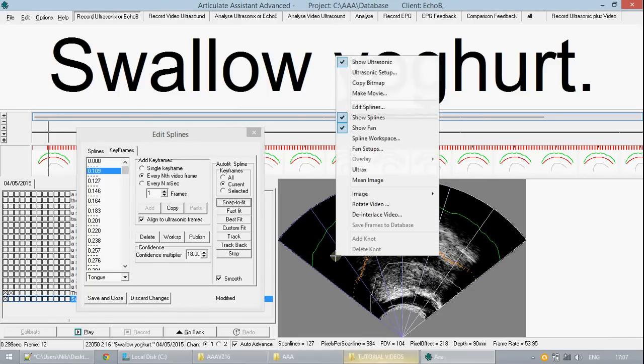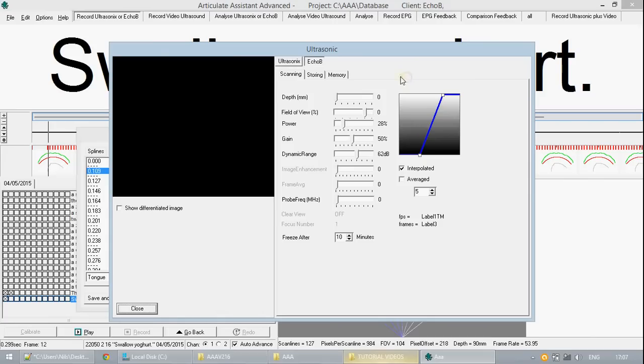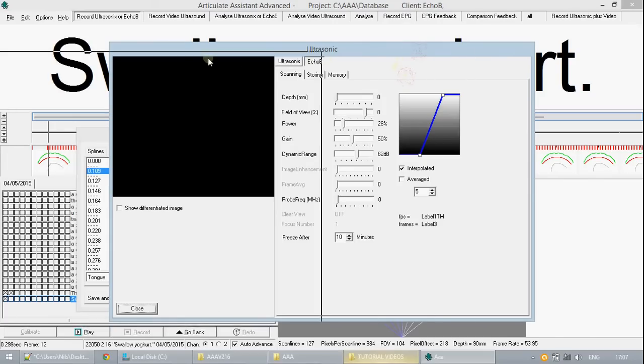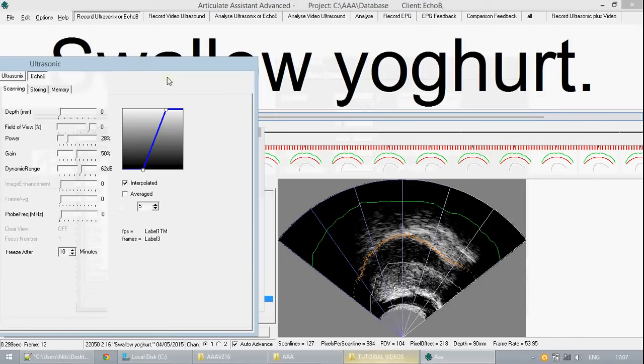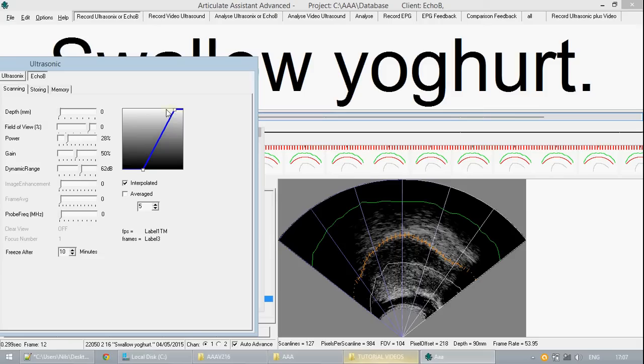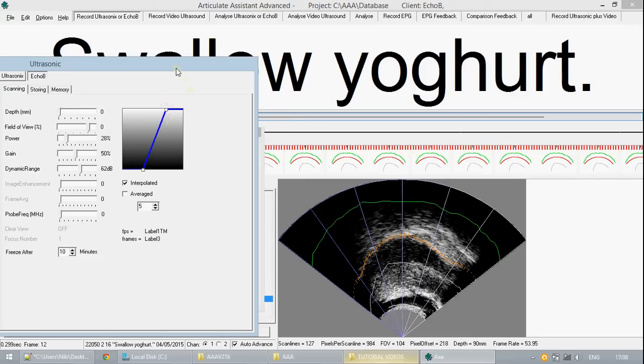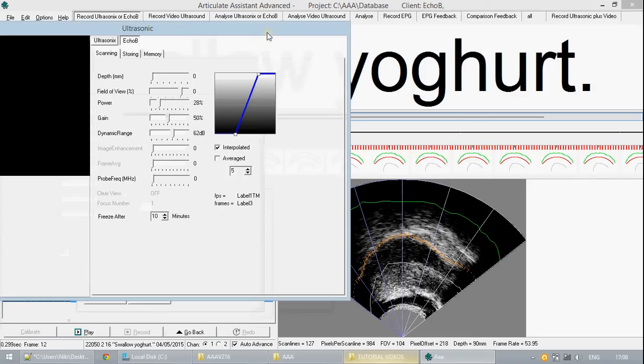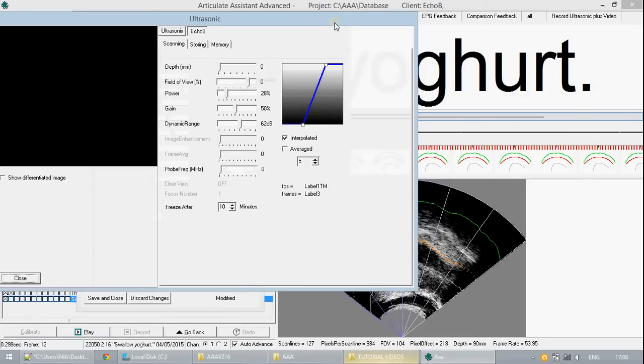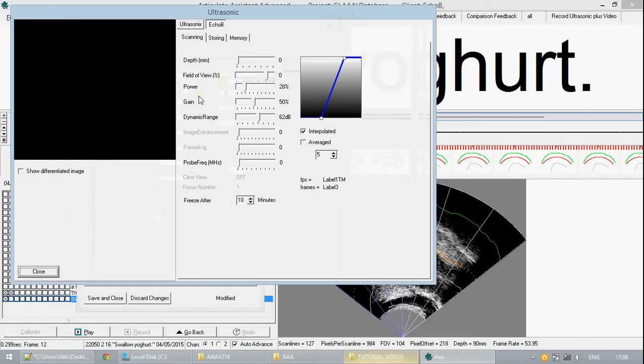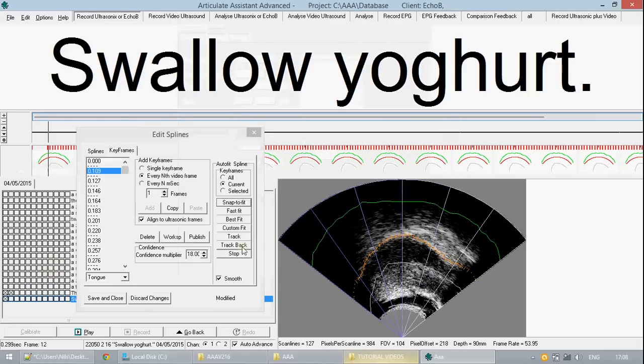If you go into the options of ultrasonic setup this gives you the power to change the contrast and the brightness of your ultrasonic image. Because the software for fitting the spline to the image works from the image displayed to you and not the raw data it is important that you change the brightness and the contrast to one that gives the most obvious shape of the tongue.